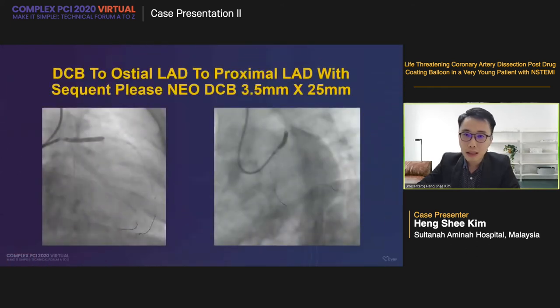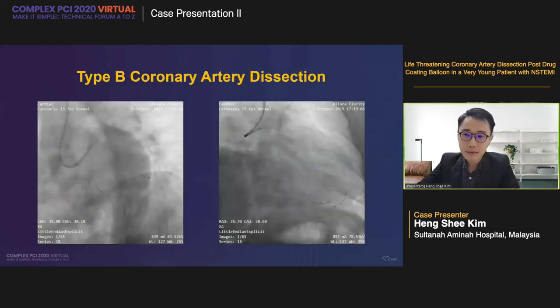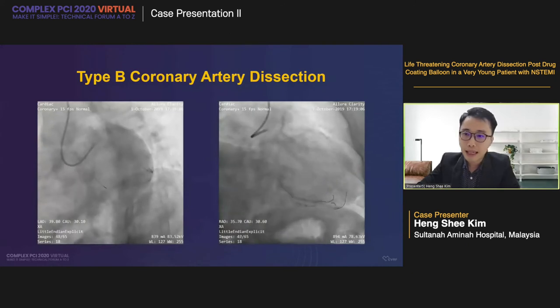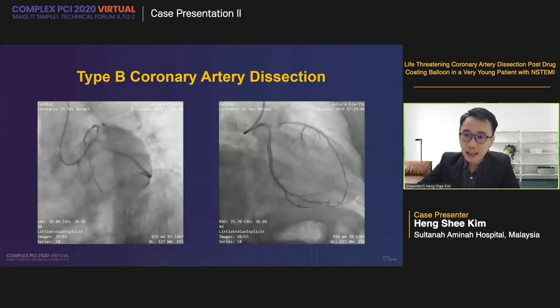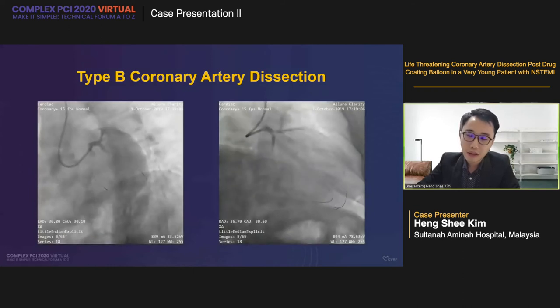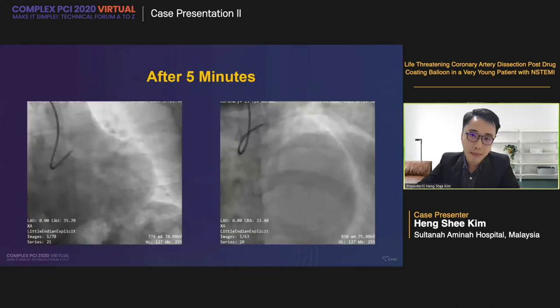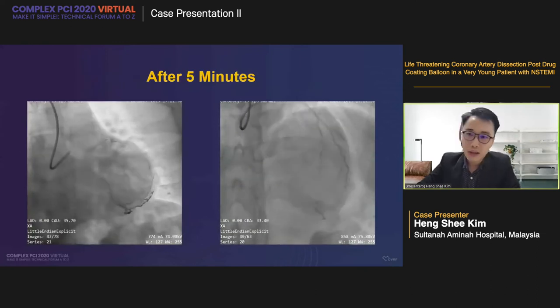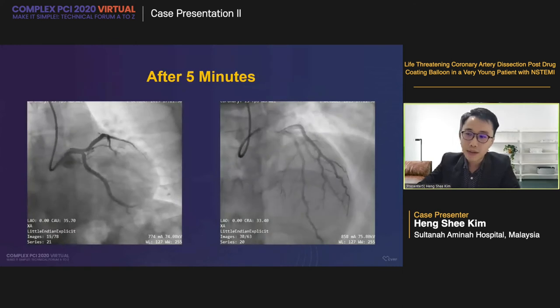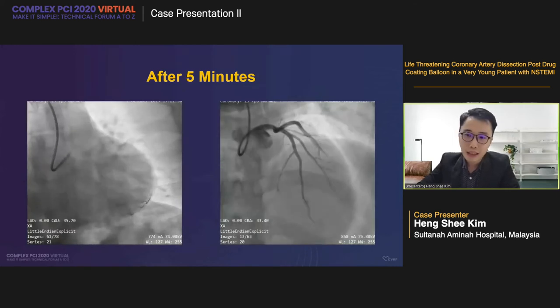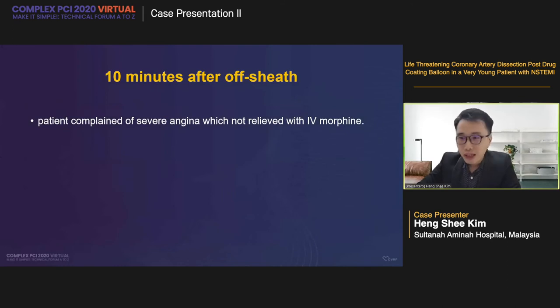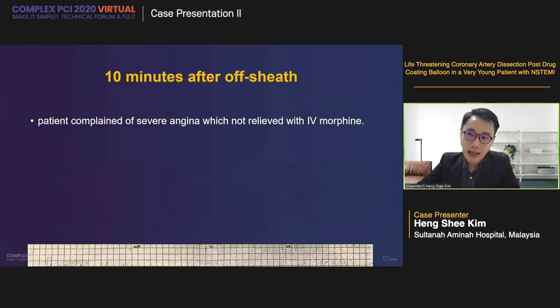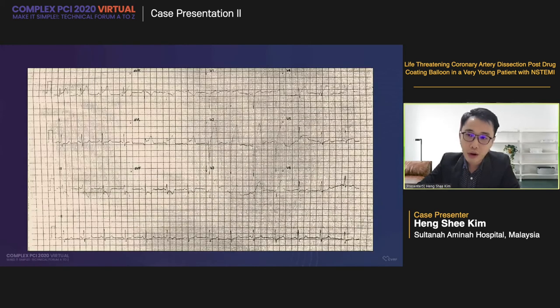According to the latest international DCB consensus, after pre-dilatation, if there is a non-flow-limiting dissection with residual stenosis less than 30%, you can consider delivering a DCB. We used a Sequent Please DCB 3.5×25, deployed at 6 atmospheres for 30 seconds. After the DCB, the type B dissection remained with TIMI-3 flow. We decided to wait and repeat the angiogram — the patient had no symptoms, no ECG changes, and was hemodynamically stable. After five minutes, everything looked almost the same. We decided to end the case, removed the guiding catheter and the radial sheet, and prepared to send the patient to the recovery ward. Unfortunately, after 10 minutes off the sheet, he complained of severe angina — sublingual GTN and IV morphine given but non-relieving. There was ST elevation over V2 to V4 with reciprocal changes — definitely an ongoing MI.